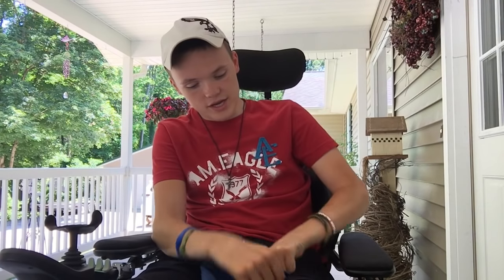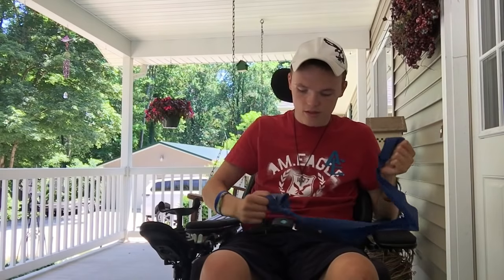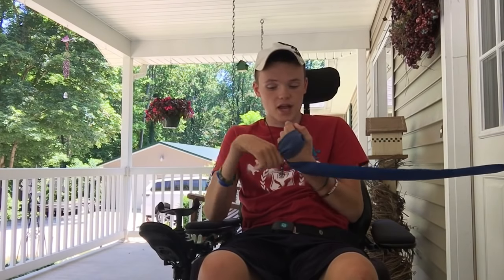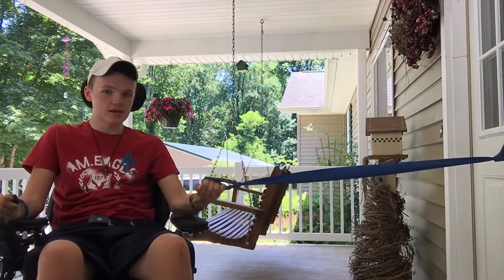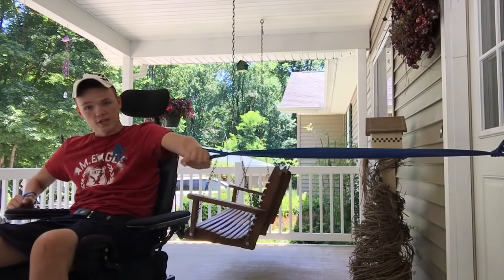So what I do is I take this, I do these by myself, and I got a lever for a door handle. It's just a lever, and you just go like this and then open the door. There's one loop that's a little bit bigger than the other. If you want to strengthen your biceps, you want to put this on the hand that is closest to the knob, and then you will go like this and get out away from it a little bit, to where your arm is extended like this, basically straight, and then you pull across your shoulder or torso like this, and you just do about 30 of those.